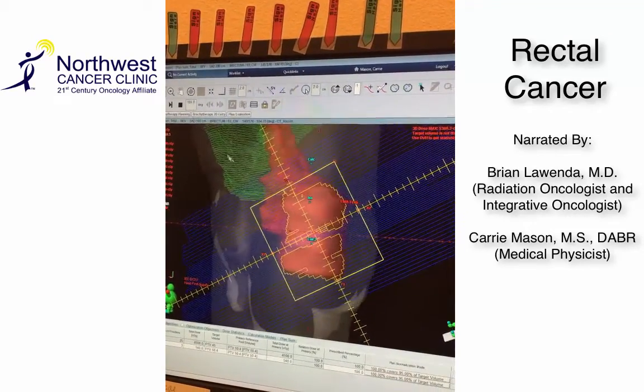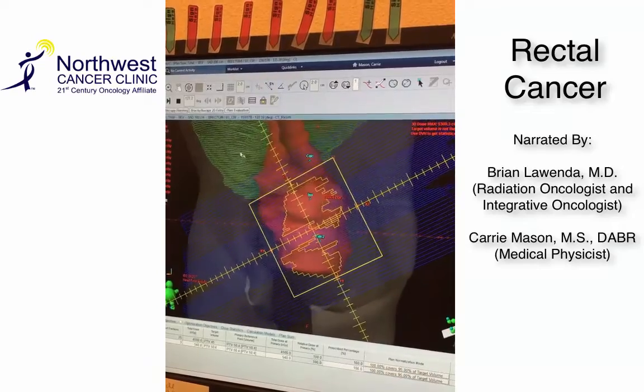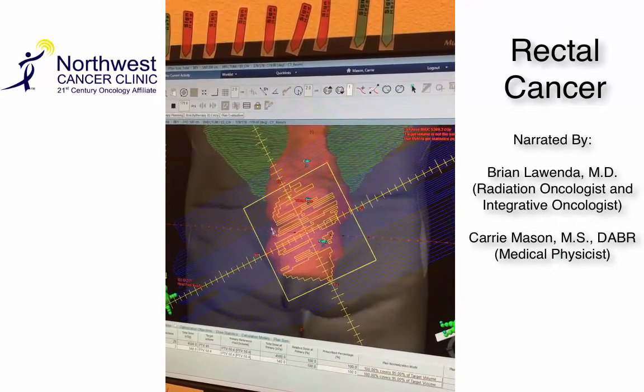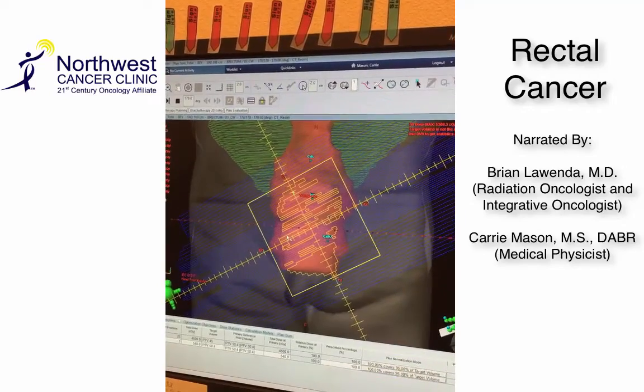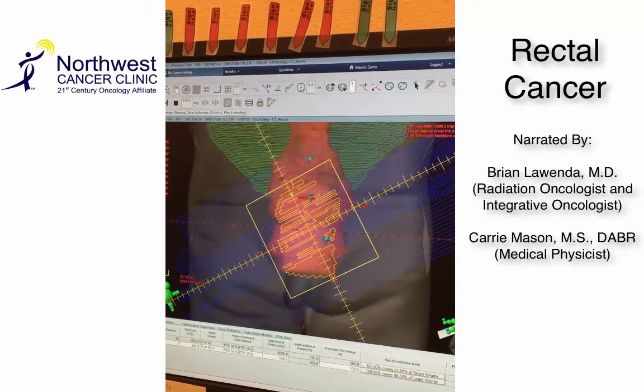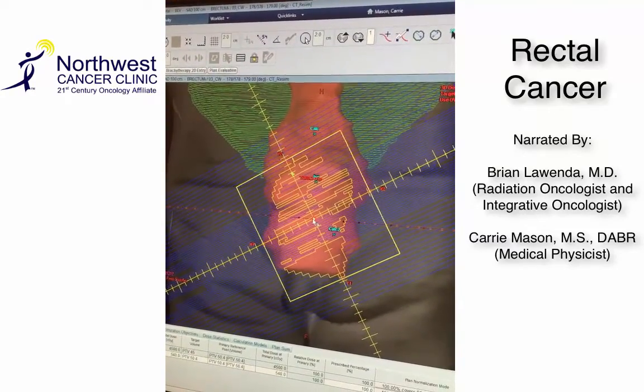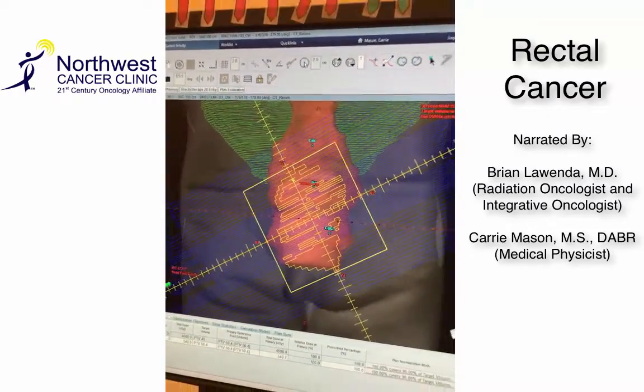The green is the bowel, so we've carved that out as best as we can. The pink structure in there is basically the rectum and the volume that we're trying to treat, and the center of the radiation field is the final volume, which is where the tumor is actually located in the rectum.